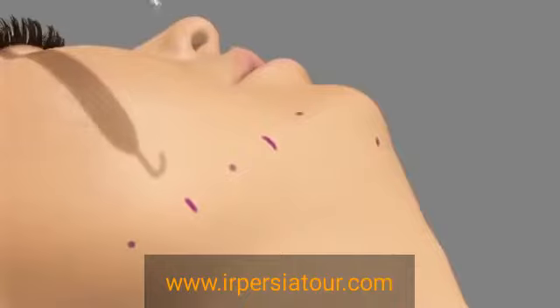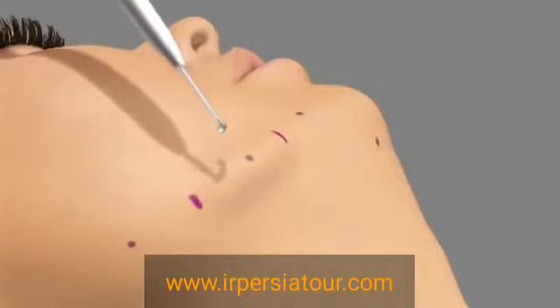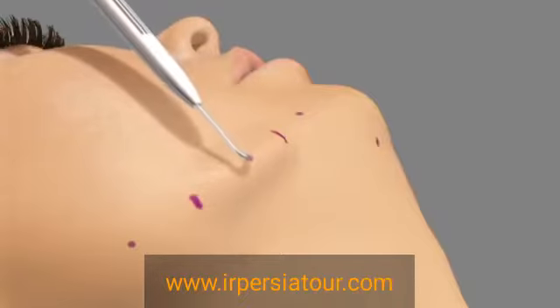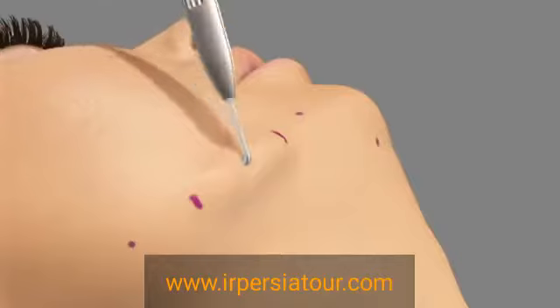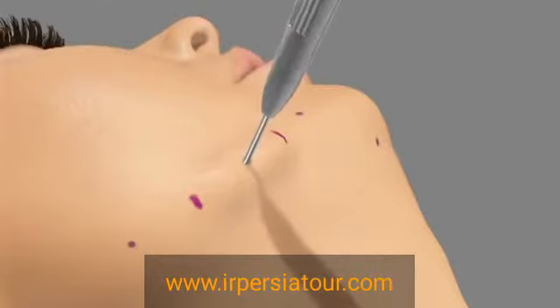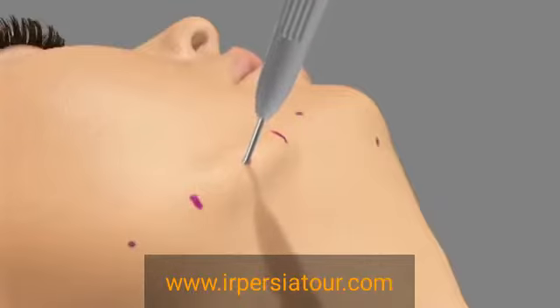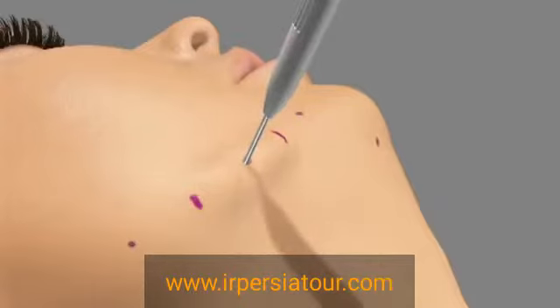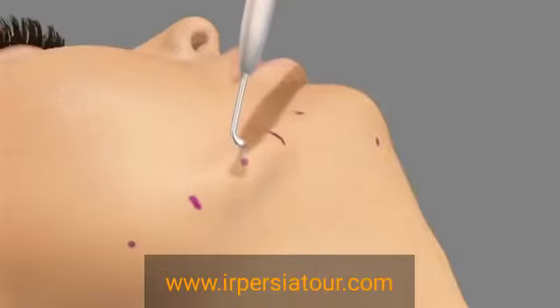The dermal attachments are then cleared using the clearing device, which is inserted in each puncture, and it is carefully rotated clockwise 2 to 3 turns, allowing the sweeping away of the dermal attachments. The sequence of each maneuver is just the same in the neck defining suture in order to create the surgical field and prepare it for the light guided suture rod.